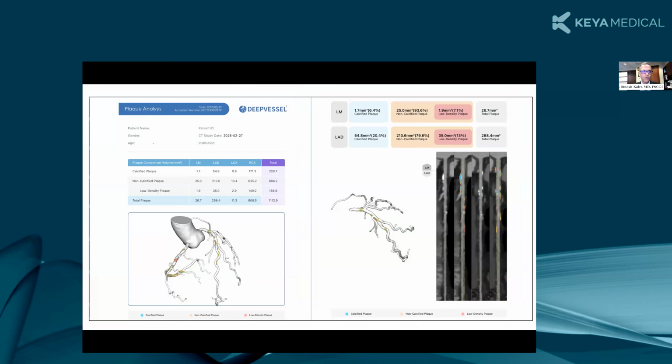But more importantly, we're focused on plaque burden. And if you look at the amount of plaque, it's relatively a lot. There are different gradings of plaque, with less than 250 millimeter cube of total plaque in all three coronaries being the lowest. You quantify that using AI by drawing the inner lumen and outer lumen of the blood vessel, and then looking at the densities, and the AI algorithm automatically assigns for you what is calcified plaque, typically more than 350 Hounsfield units, or soft plaque, or low attenuation plaque, which is less than 30.